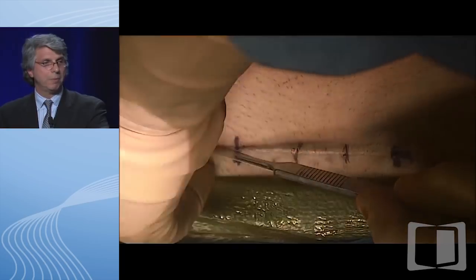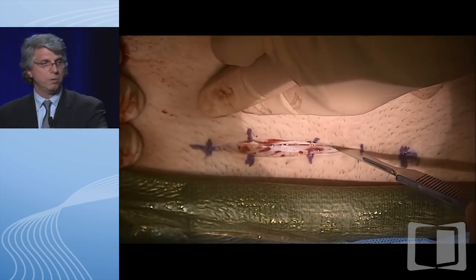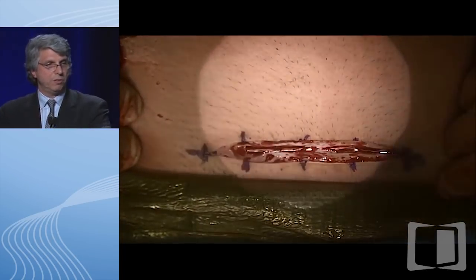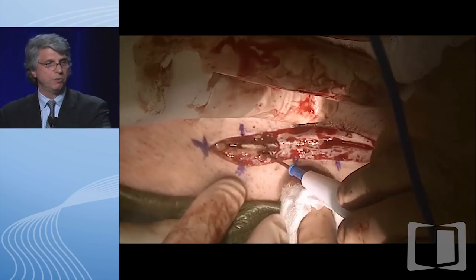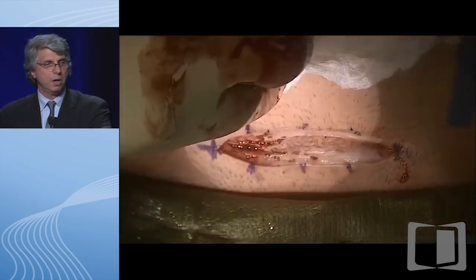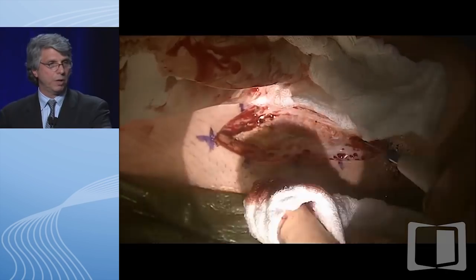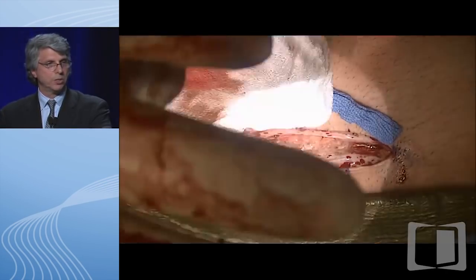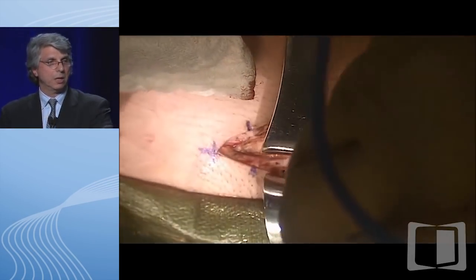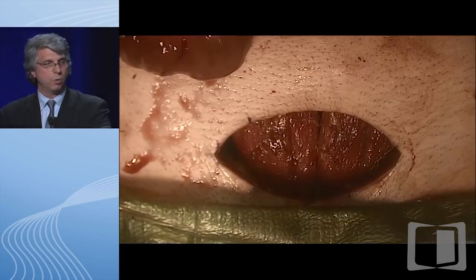We then go into the abdominal wall again, just like we did the first time. This time around, because of scar tissue, the dissection planes are a little more interesting—they can sometimes be fairly bloody and the tissue planes are abnormal. We continue this dissection down to the fascia and the muscle, and then we put in a wound protector, just like the first time. The wound protector is one of the only things that has been shown to consistently reduce wound infections, which is a major problem after colorectal surgery. The plastic sheath protects the skin from bacteria disseminated through open bowel or at the time of surgery.